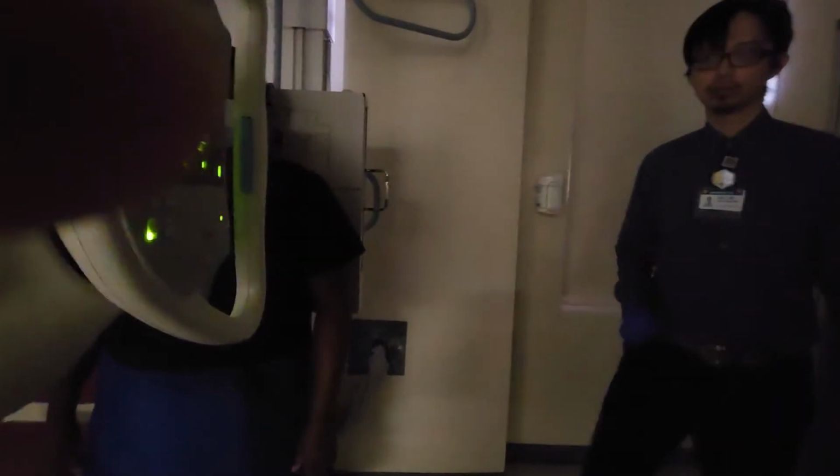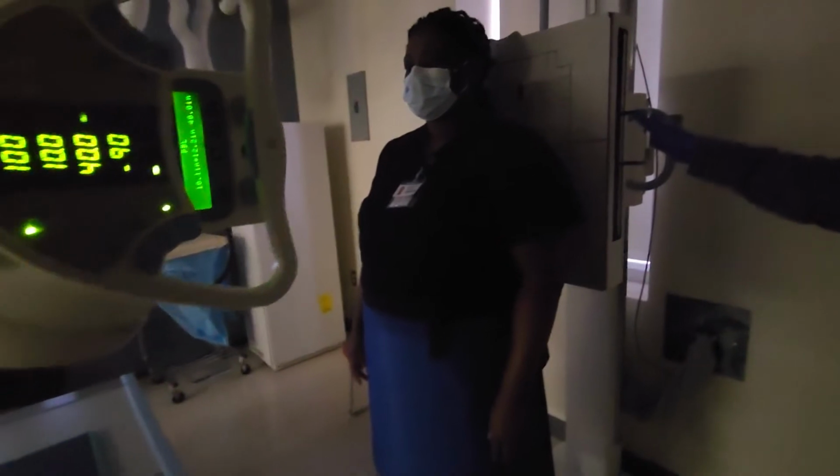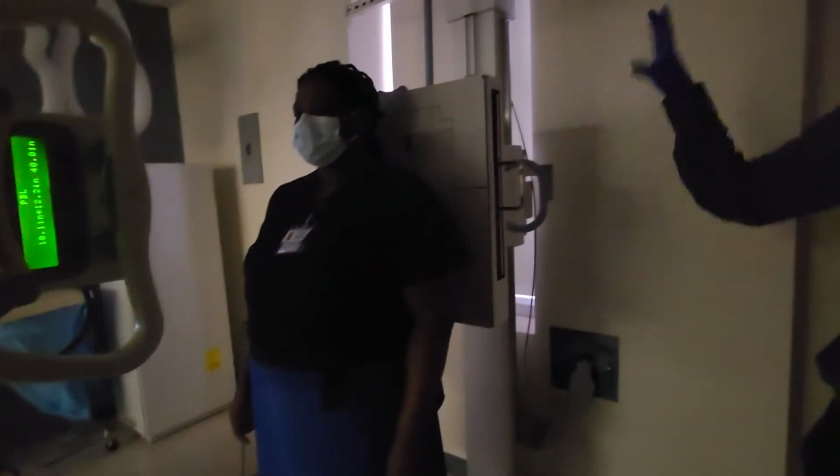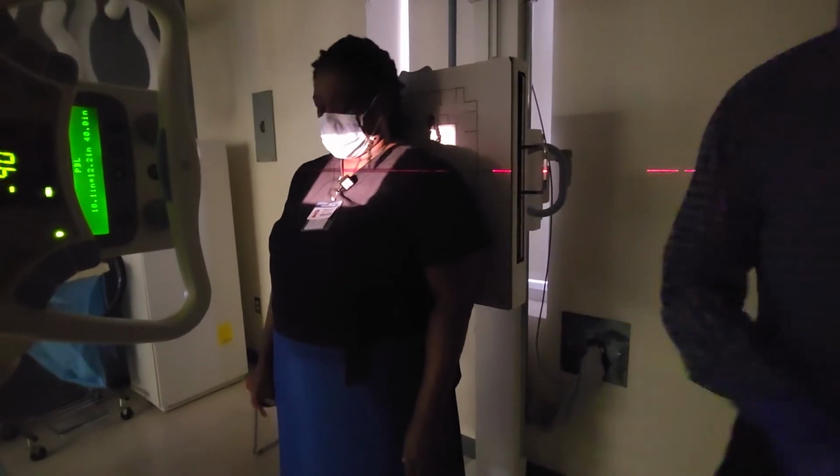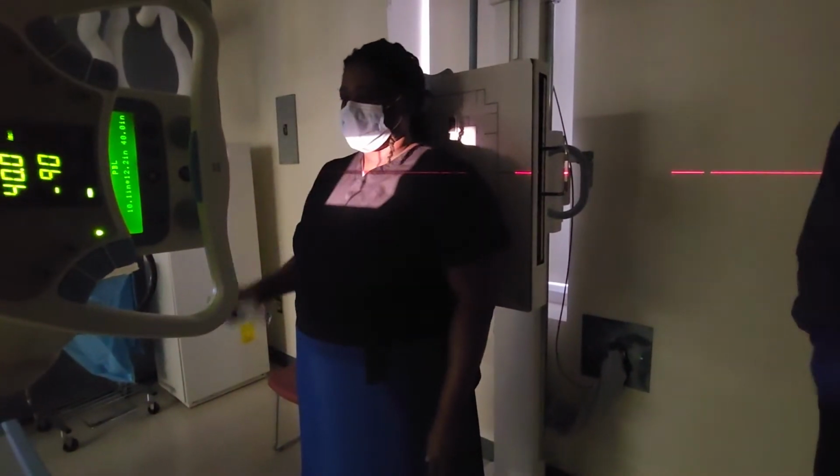We're good to go. By the way, the machine will be able to detect what the cassette is inside if you properly clamp it in. So it will give me the correct collimation in the correct orientation.